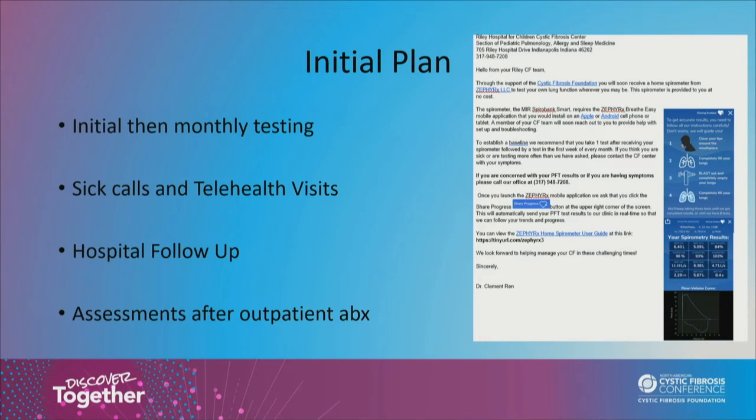We asked them to please call if they felt sick, because we didn't want them to use the spirometer as a self-diagnosis tool. And we also used it for a lot of the things that were mentioned in Greg's introduction: sick calls, telehealth visits, hospital follow-ups if we didn't think we were going to see the patient very quickly after they were discharged, and assessment of outpatient antibiotics that may result from those sick calls or sick visits.